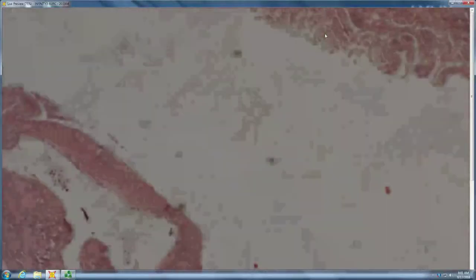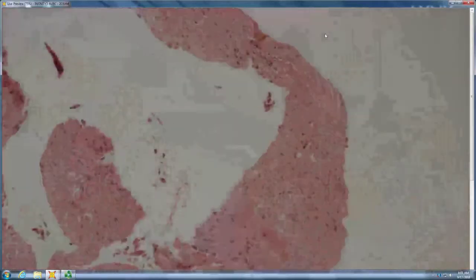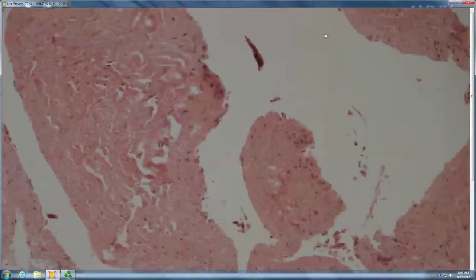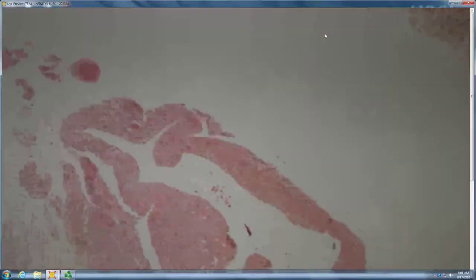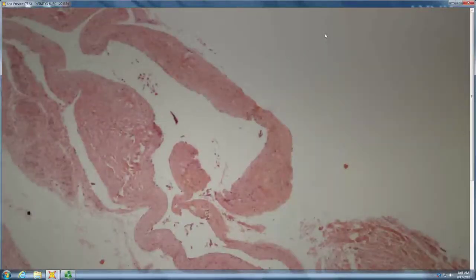Cystic structure there. Cystic structure with an epithelial lining? No. Not really, right? It's kind of fibrous with those plump fibrocytes lining it. So what kind of cyst is this? Fibrocyst. That's actually not bad. That's what a ganglion or metaplastic synovial cyst looks like.